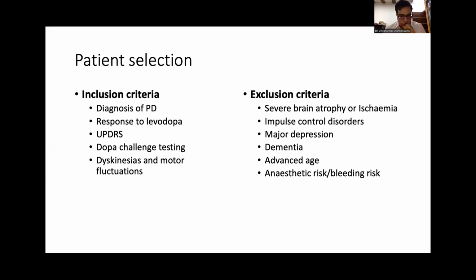As you can see, the effect is right there on the table, and we can pick up any side effects as well. But the main important thing is to select the correct patient for this. So which are the right patients? As far as Parkinson's disease is concerned, it should be a patient with idiopathic Parkinson's disease. Secondary Parkinson's and Parkinson's plus do not benefit from this. One way to check is if levodopa does work for the patient, then DBS will also work.